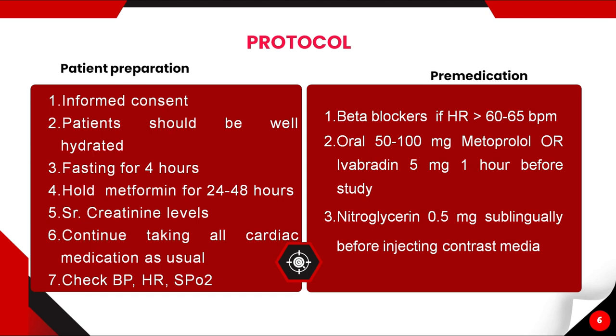Patients are instructed to hold metformin for 24 to 48 hours to avoid metformin related lactic acidosis. Serum creatinine of the patient should be checked before the procedure. It should be less than 1.6 milligram per deciliter, and patients are also advised to take cardiac medications as usual.